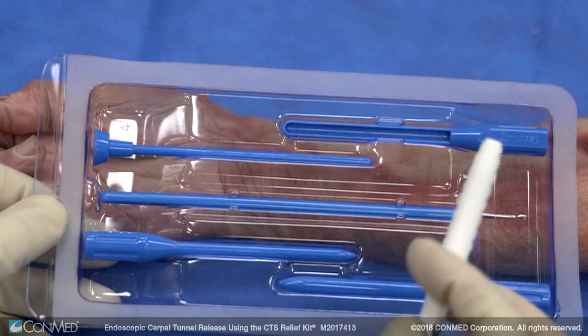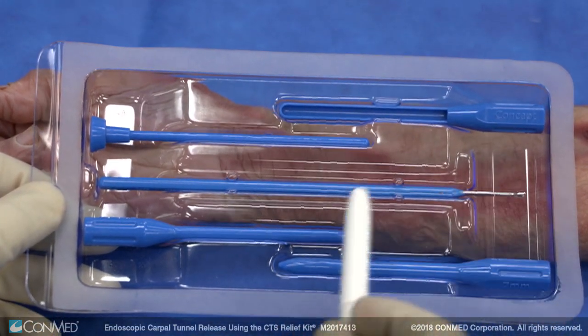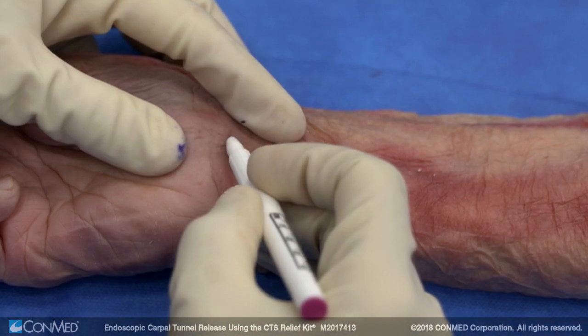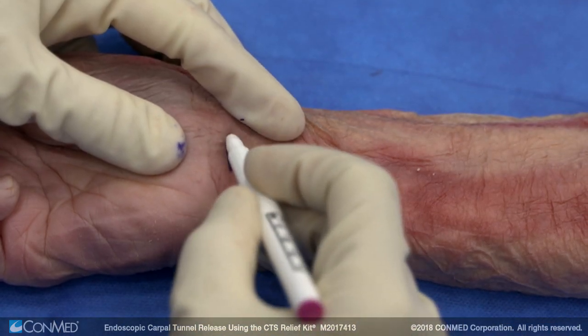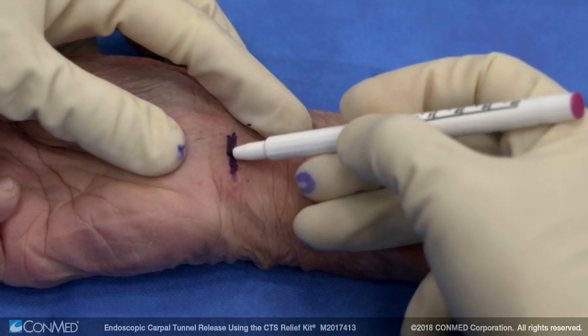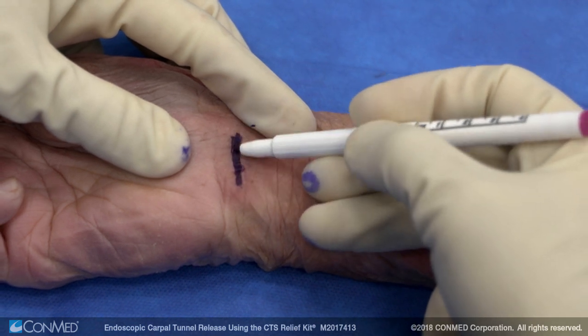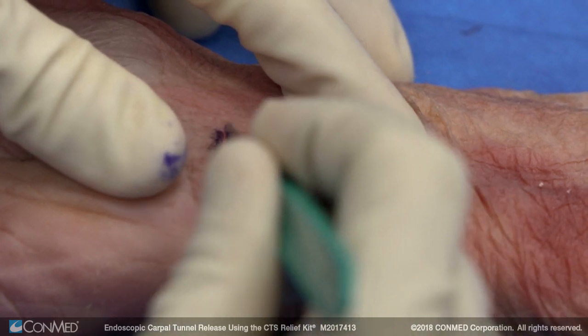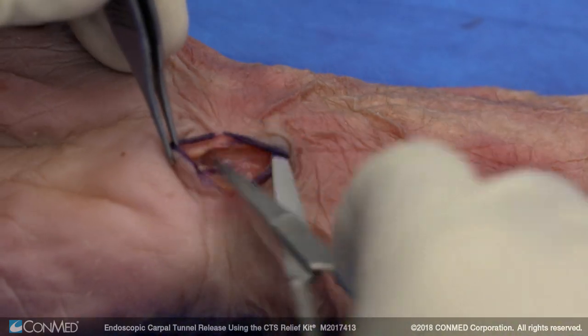Here's the carpal tunnel release system with the guide, the dilators, and then the blade. We'll do our standard exposure. The incision for this system is proximal based — you make about a one to one and a half centimeter incision just over and then slightly ulnar to the palmaris longus tendon.